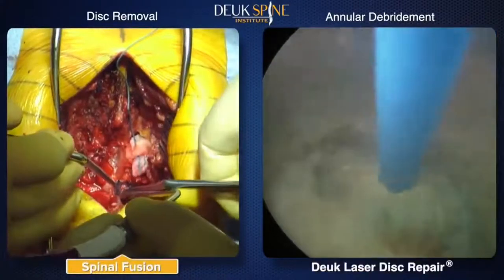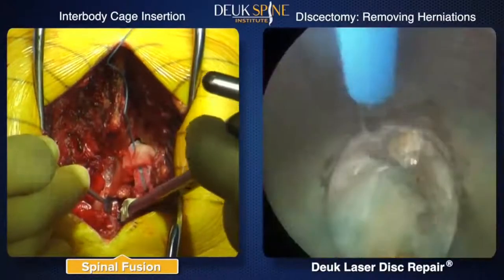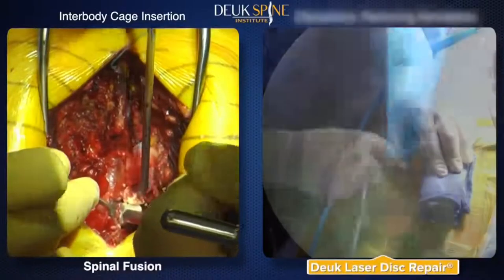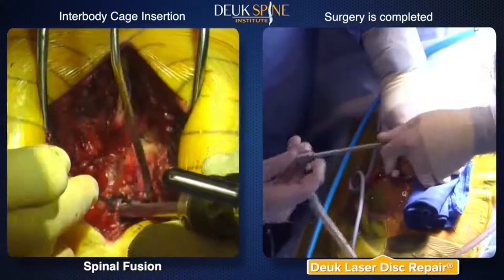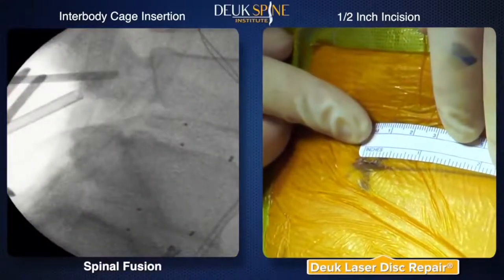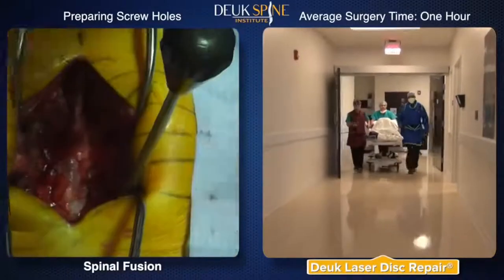After the fusion patient's damaged discs are removed, a metal or plastic cage housing bone grafting material is inserted in place of the removed discs. Once the laser has removed the painful part of the annular tear, the endoscope and tubular retractor are removed, leaving less than 1/2 inch incision in the skin, which is closed with a single stitch, steristrips, and a Band-Aid. Total time for the Deuk laser disc repair surgery, approximately 1 hour.